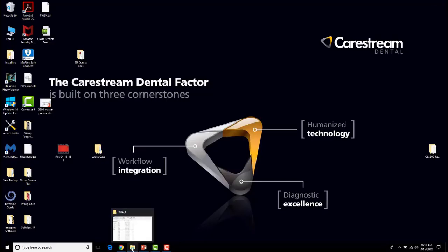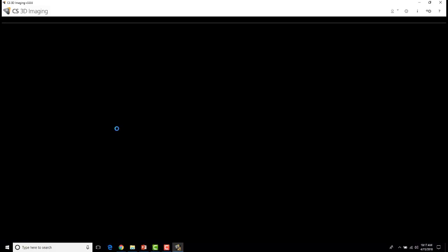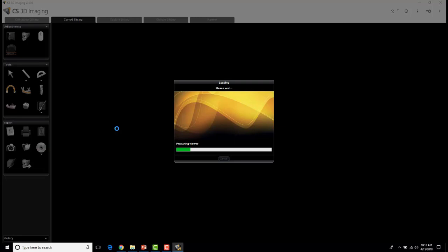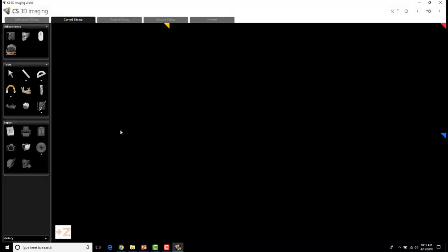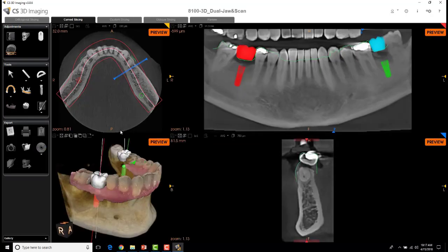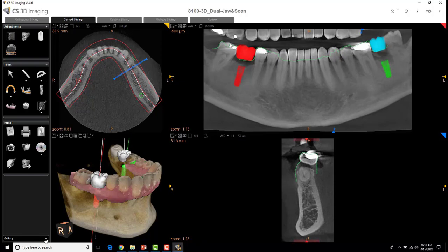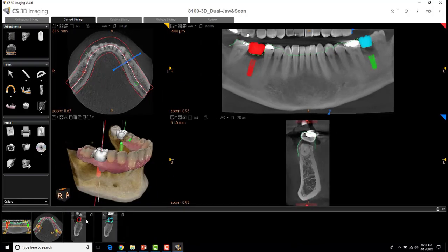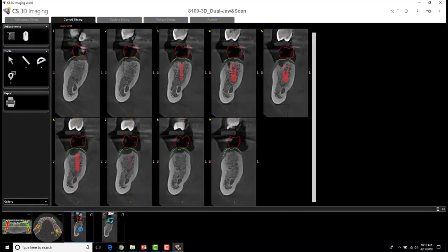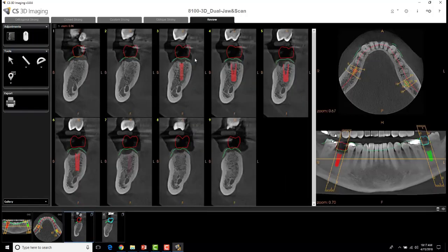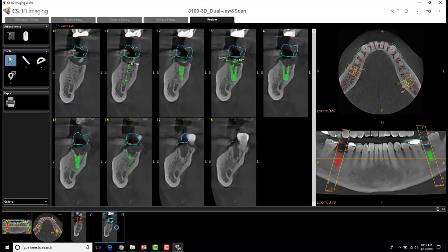So if you close your software, the next time you open up your scan after you've already treatment planned, it becomes very easy to see everything you've done with just a couple of clicks. It will default to the curve slicing tab. If I want to see everything I created from those cross-sectional reports, I just open the gallery and I have these two images with multiple layers. I can double-click on one of them — it opens up those slices from the report in the review tab — and if I want to view the other implant I just double-click on it, and it opens up all those slices with all the individual measurements already attached to each individual slice.